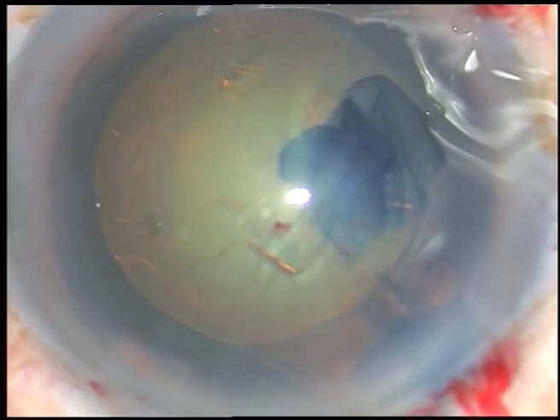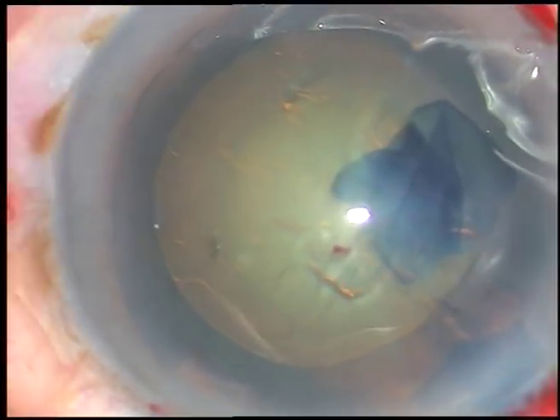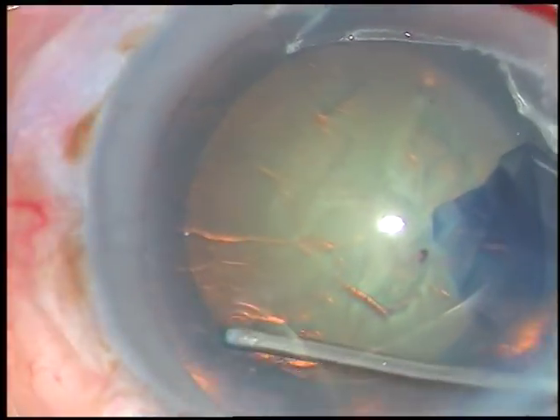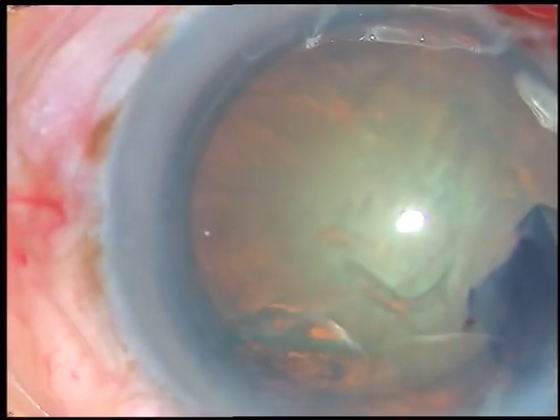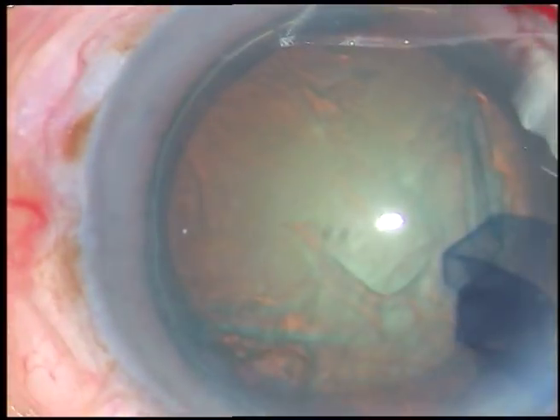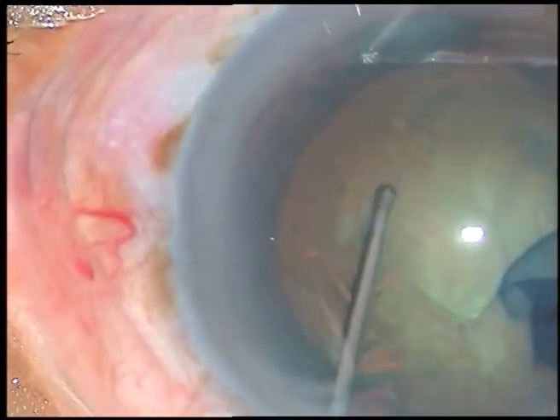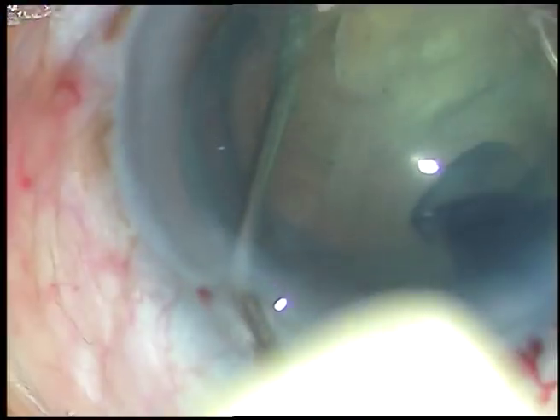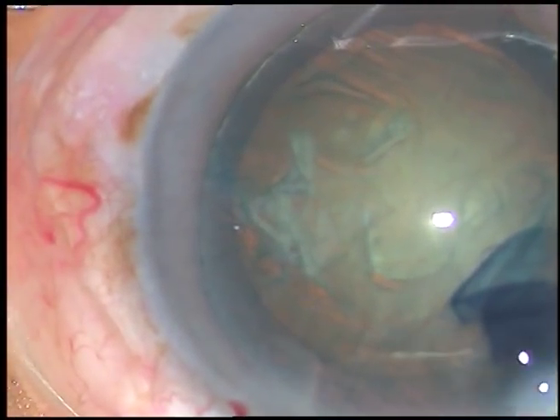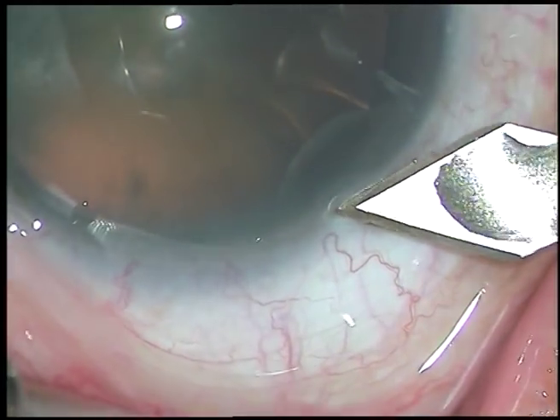This is almost a circular rhexis. Now see how hydrodissection is done. A fluid wave is passed from one side to the other side. Depress the nucleus and see that the fluid comes anteriorly. Then rotate the nucleus — the fluid wave should come anteriorly along the equator.